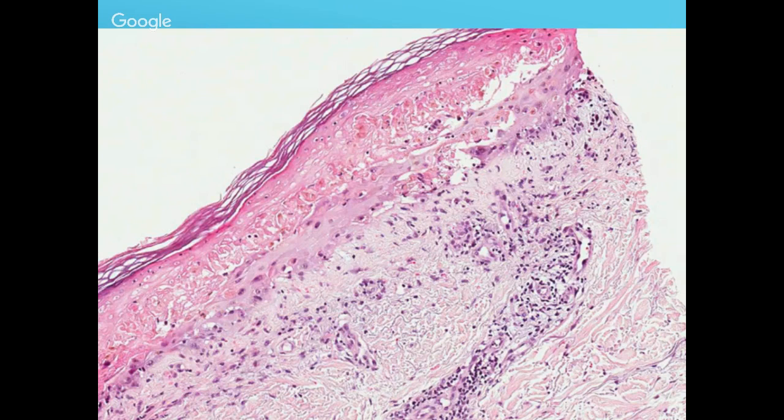Now, erythema multiforme is a very acute reaction pattern because it is not like a chronic reaction pattern. The patient suddenly develops erythema multiforme to a variety of reasons. It could be to a drug, it could be to some sort of viral infection, it could be idiopathic, but they develop these lesions very acutely actually. And that is the reason when you read about erythema multiforme, they talk about a basket weave hyperkeratosis. So this pattern that you see here is a basket weave hyperkeratosis. And what does that signify? That is telling you that this is an acute reaction pattern.